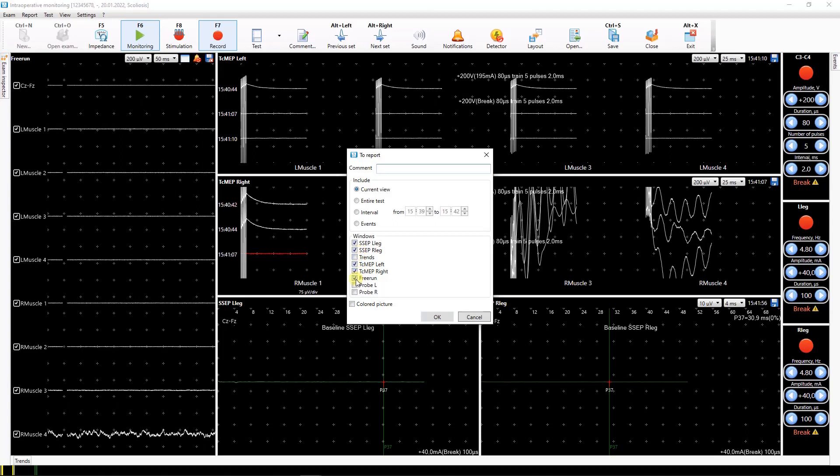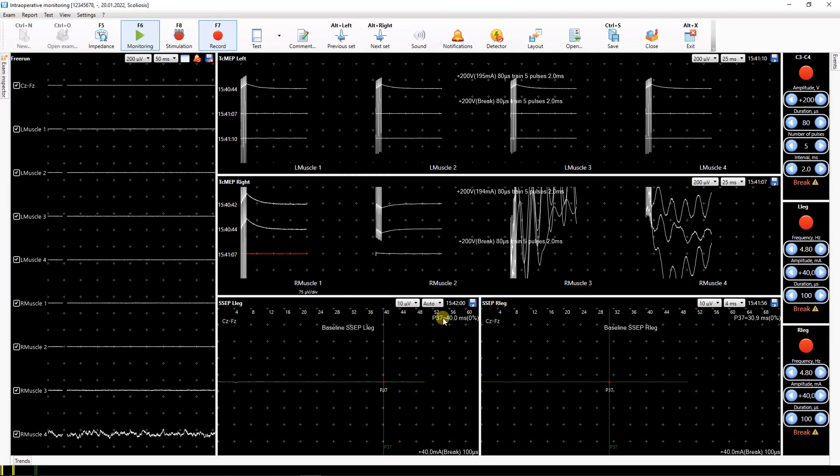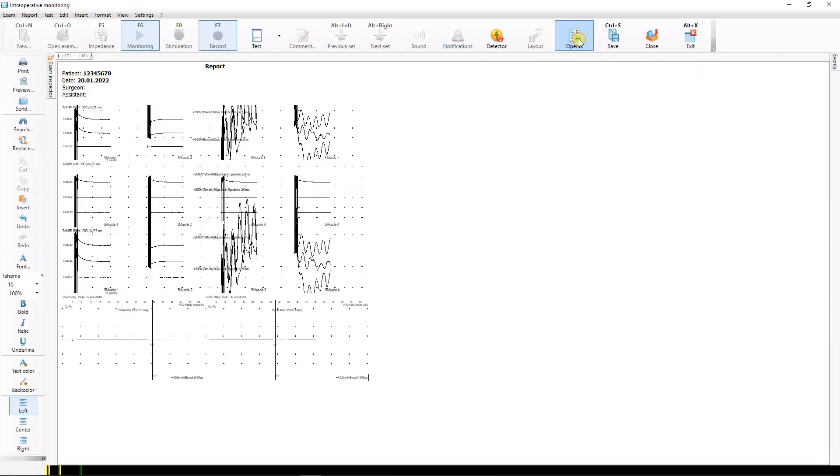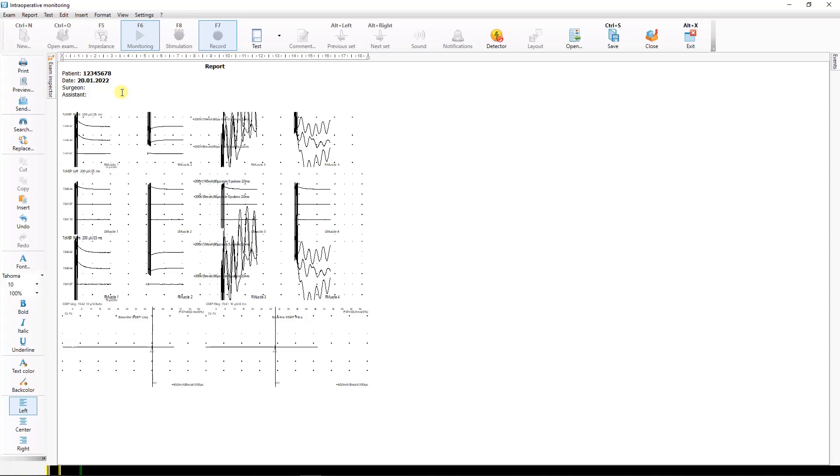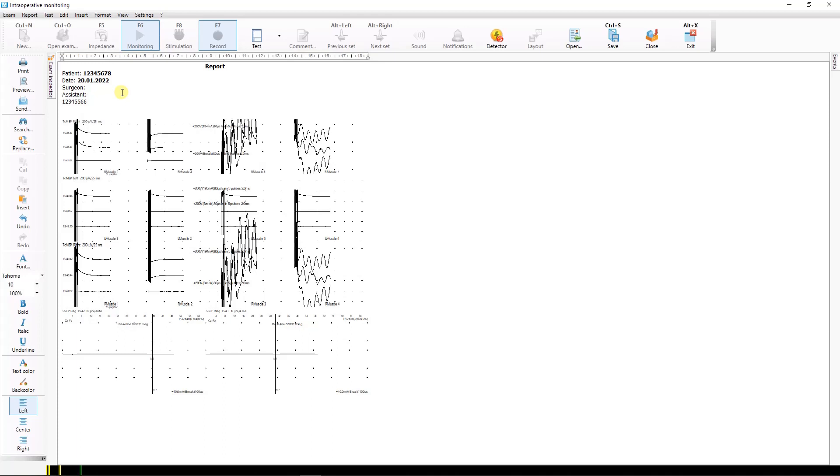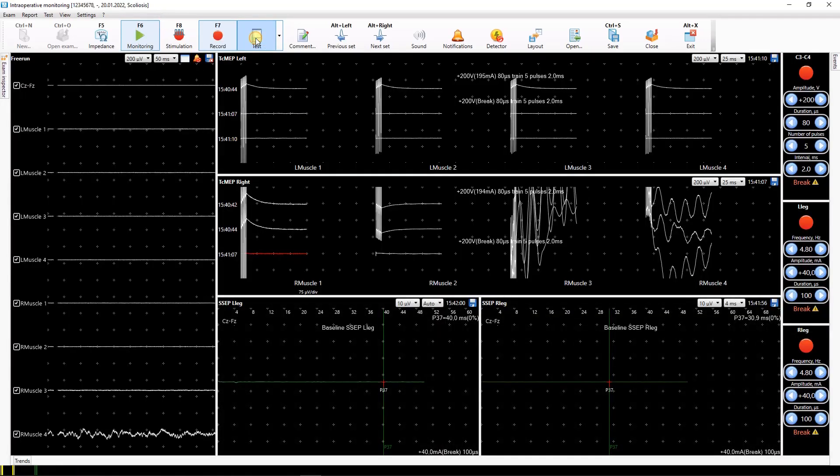Here you can select what data to copy to the report. To view the contents of the report, click the open report button on the toolbar. The report editor window will appear on the screen. To return to the test window, press the test button.